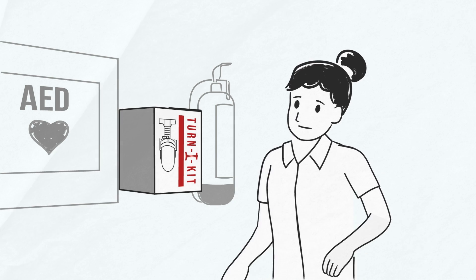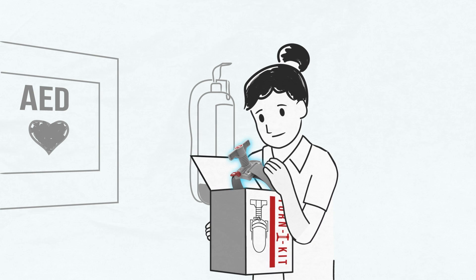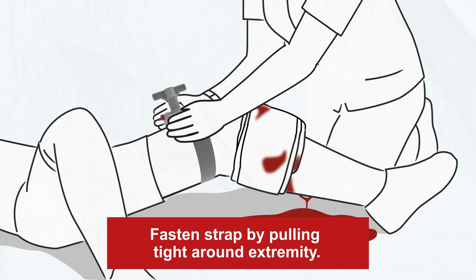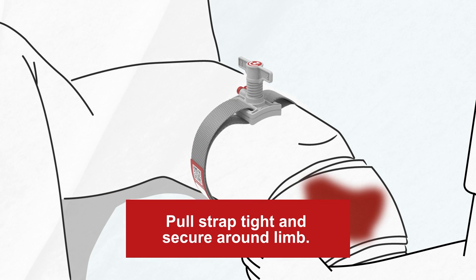Remove the tourniquet from the box and loosen the hook and loop strap. Step 1. Fasten the wide Velcro strap tightly around the extremity at least 2 to 3 inches above the bleeding site. The strap should be fastened tight enough that your fingers cannot slide between the skin and the strap.